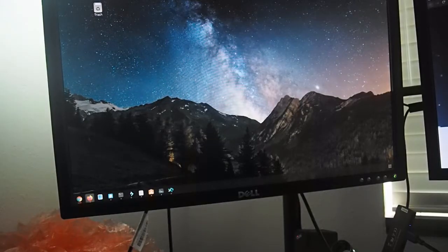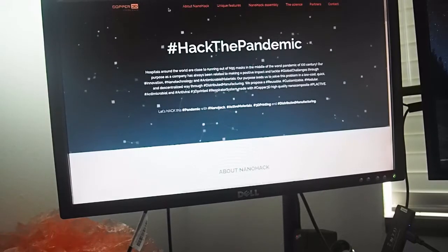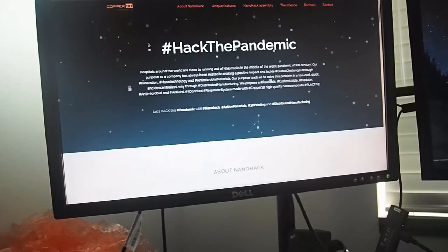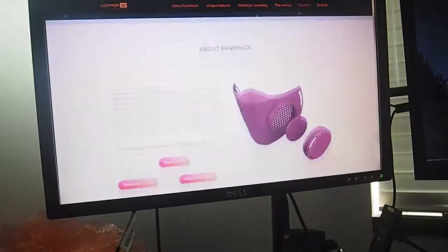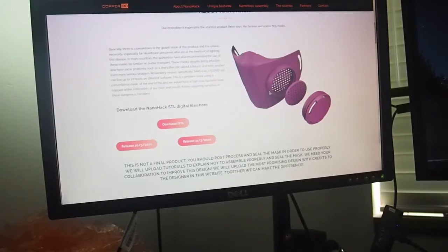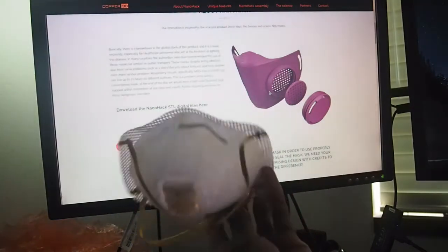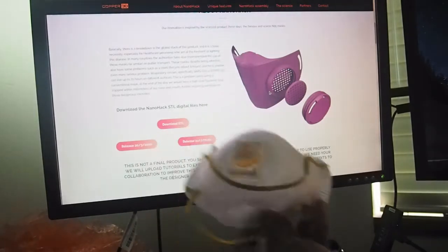Alright, so first up, we've got to start from the design. There's a website, copper3d.com/hackthepandemic. If you go to this website, you get this pretty trippy little display. It's a company who made a design for a 3D printed high quality mask. The mask we're going to be making will actually be similar in effectiveness to an N95 like this, but it will be non-disposable. So that means you can clean it and reuse it, hopefully.